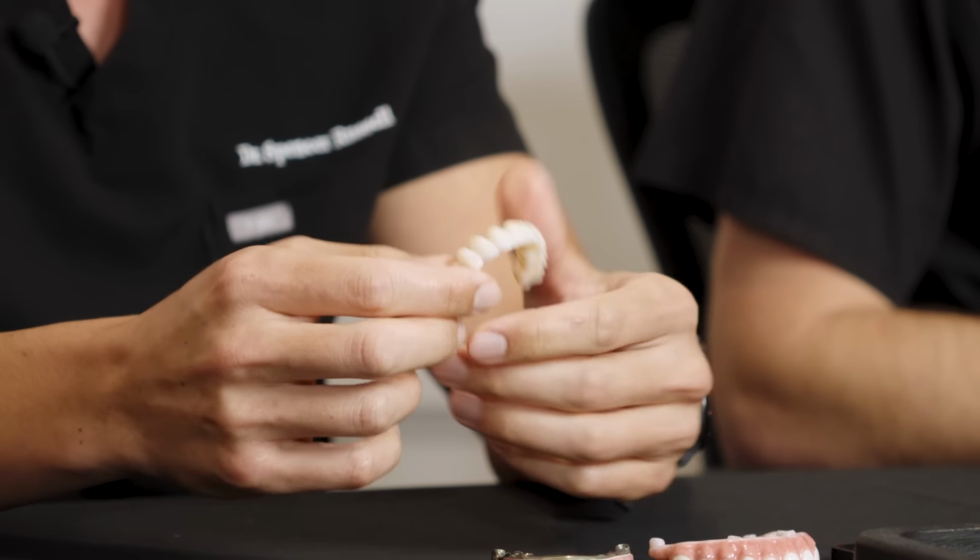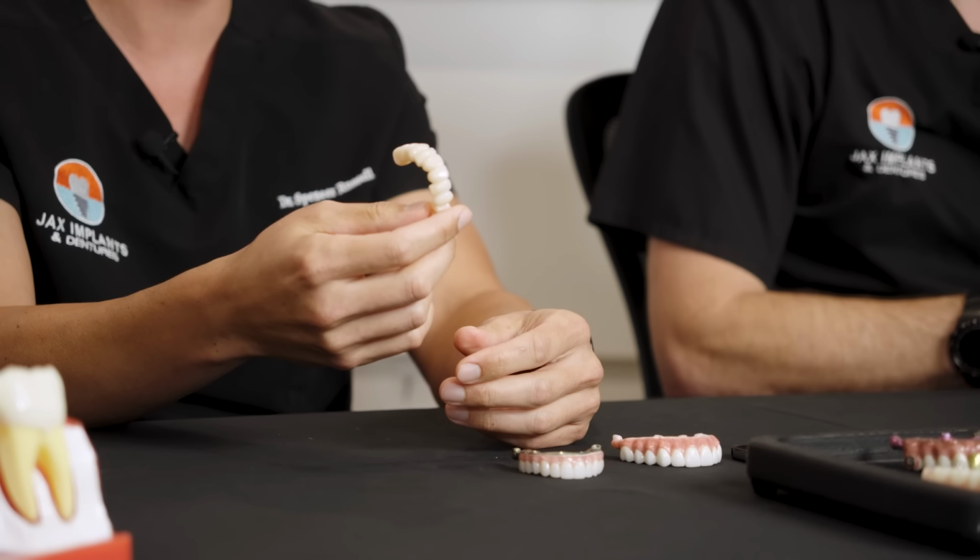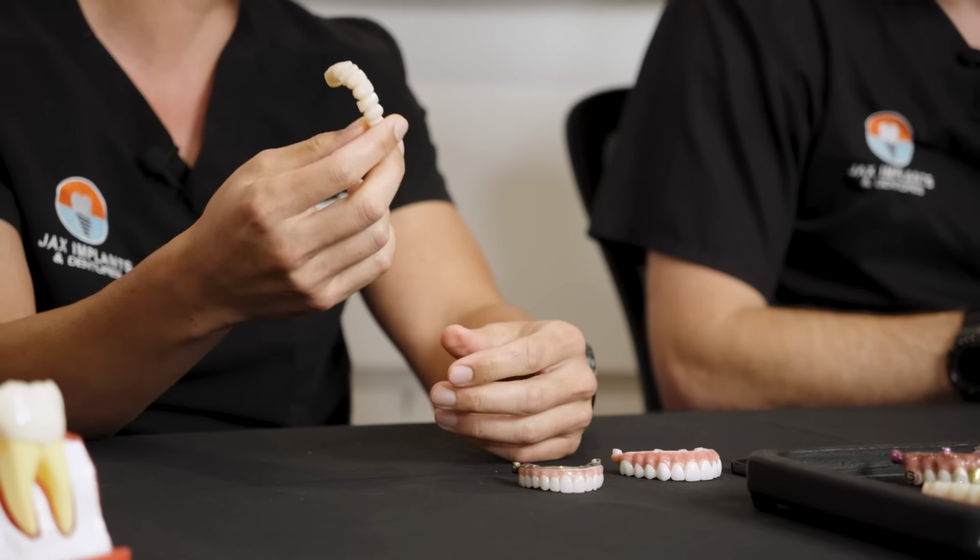So still a great style. Still ask your local dentist, hey, am I a candidate for that style? It's the same price and everything else, but just be aware that it's not for everybody, but ask about it. Yeah, I would say the most common thing that we see there is somebody's missing some teeth and you have this big dip in your gums where your gums are receded. You can imagine if that was sitting there, it would have this big gap and just wouldn't look right. So very, very select cases, and a little bit more work involved, making sure you're going to have a really good outcome. But in those scenarios, very good option for people.